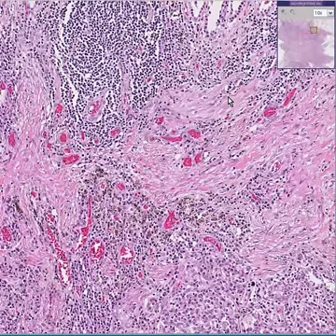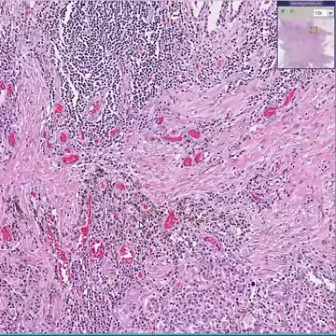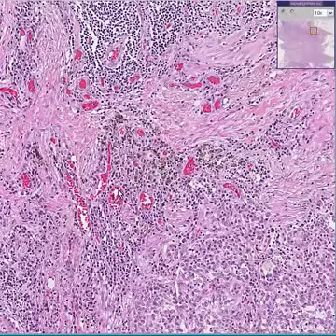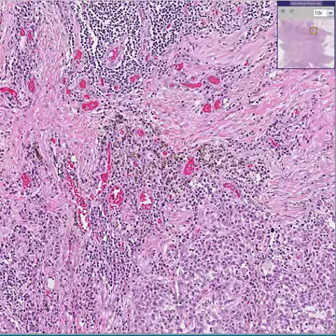These little nests here are tumor cells. Here's lymphocytes. This little nest with pigment is probably macrophages that have taken up blood pigment, because you can see there's a lot of blood vessels around here. So the more this tumor has hemorrhaged, especially chronically, the more likely you are to see these little hemosiderin-laden macrophages within the hemorrhagic area.